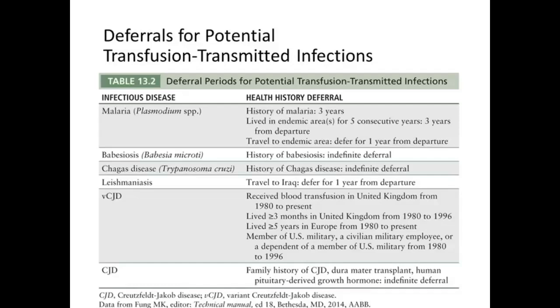Now the book says premature infants, but I think all infant or baby transfusions are CMV negative. You'll see the unit of blood, and that unit will be tagged CMV negative to alert.